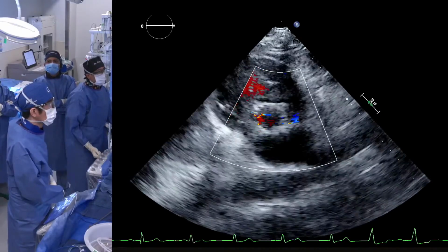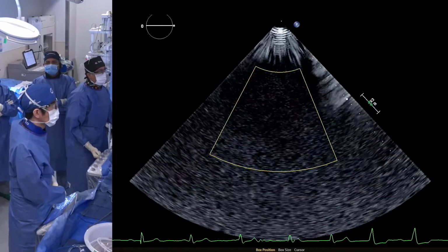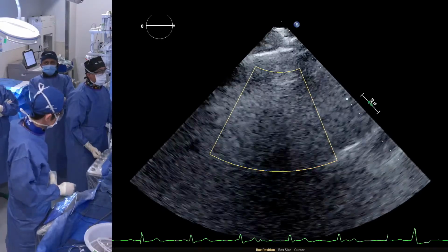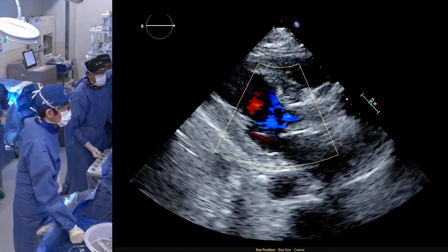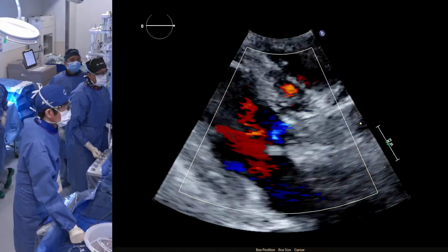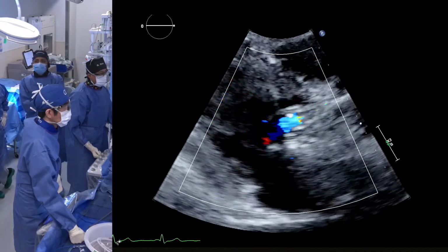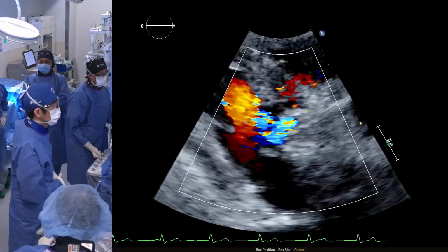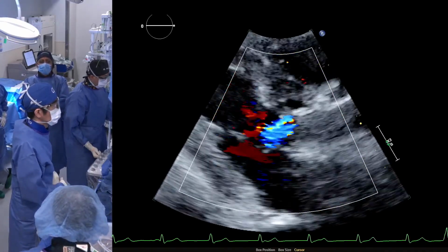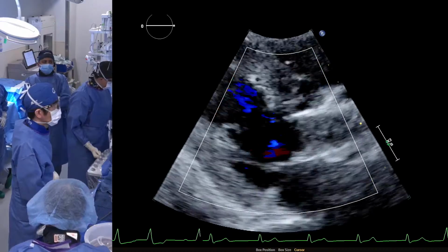Yeah, the diastolic pressure didn't change at all after the TAVR. But we saw that there was no gradient. So it's some PVL, as you see. There's some PVL, more than mild, mostly moderate PVL. You're saying moderate PVL. That could be that calcium nodule on the right side.